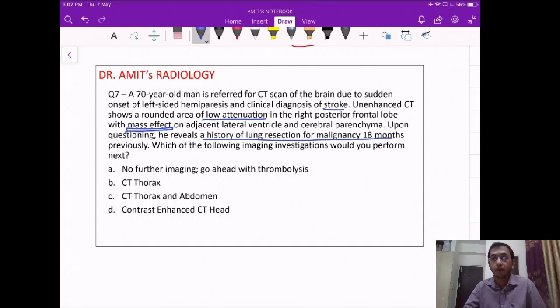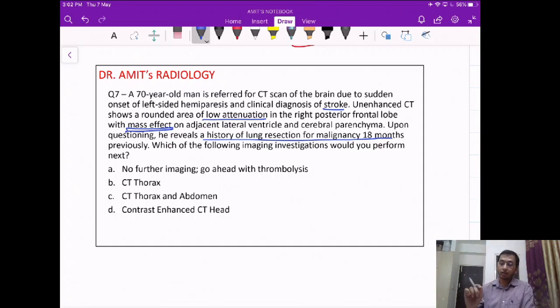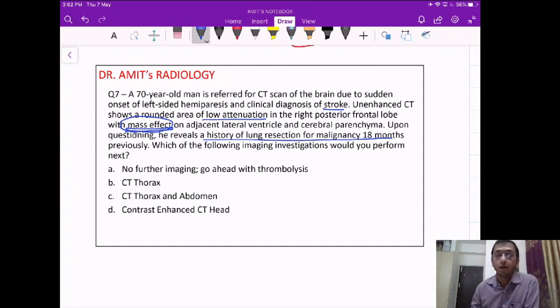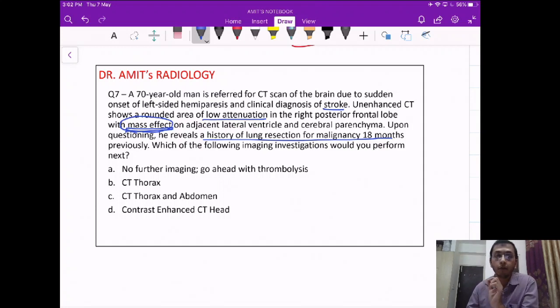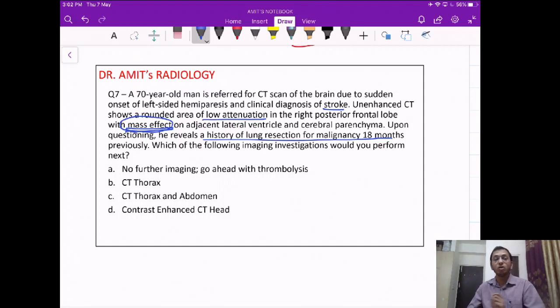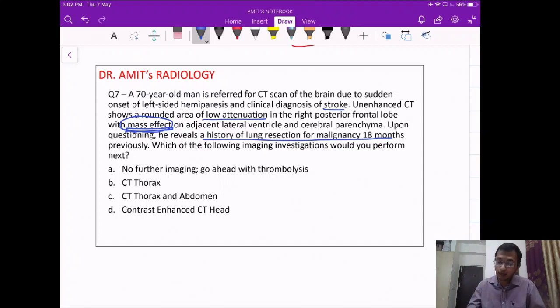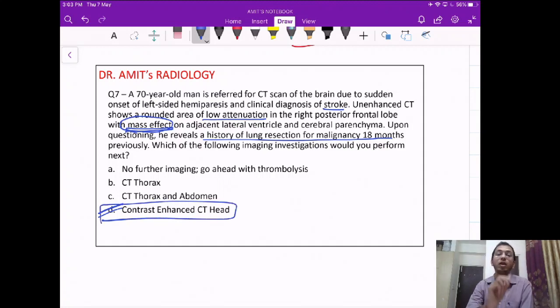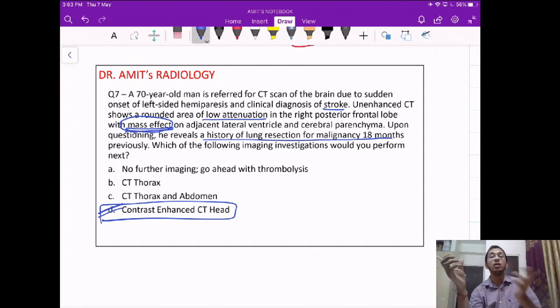For ischemic stroke, the next step would normally be thrombolysis. But the lesion shows mass effect — importantly, acute infarct does not cause mass effect. Plus there is a history of CA lung. So we are worried: is it a metastasis? We cannot proceed with thrombolysis because if it is a metastasis, it can lead to hemorrhage within the lesion. To differentiate, we need to look for contrast enhancement.